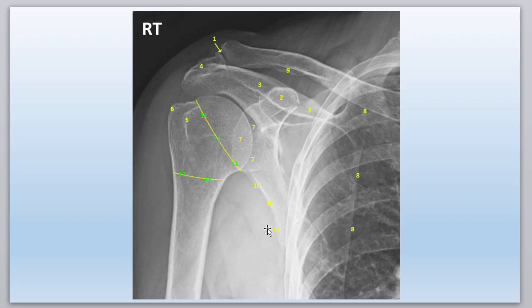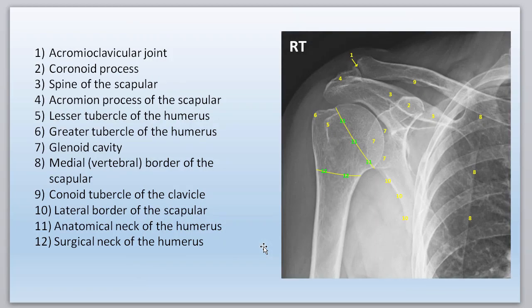Let's see if this is going to behave. It slides down. Next slide down. Oh, look, I got a lot of little numbers for you, so you can quiz yourself right here. I think I covered all of these, so I don't need to talk about this slide, but you can take this quiz. So pause this, get out your paper, and take this quiz. And here comes the answers.